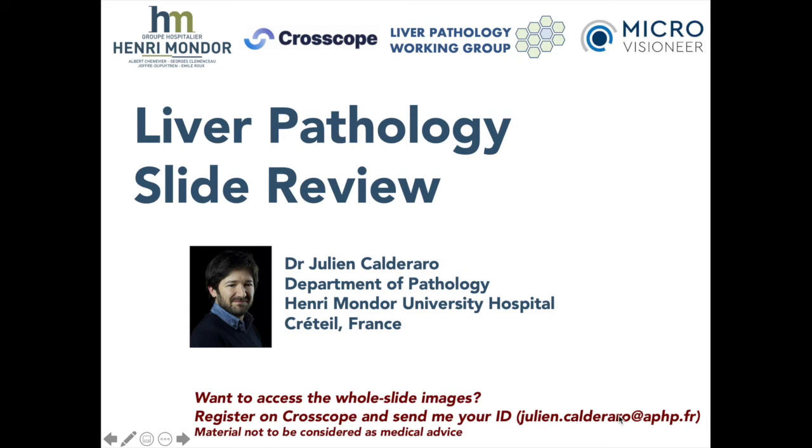Welcome for the third case of the liver pathology slide review. Remember that you can have access to the whole slide images on Crosscope.